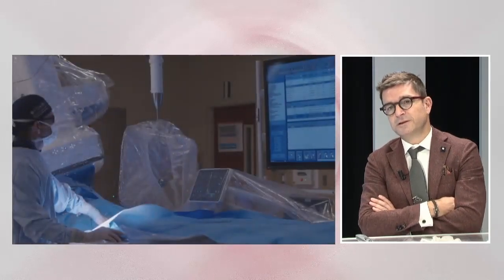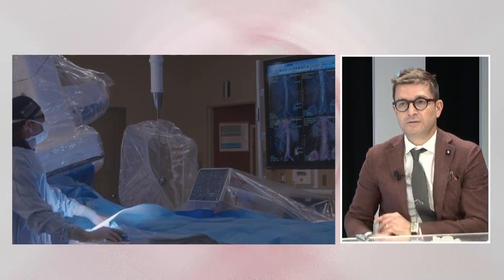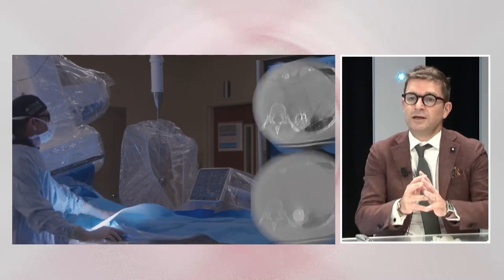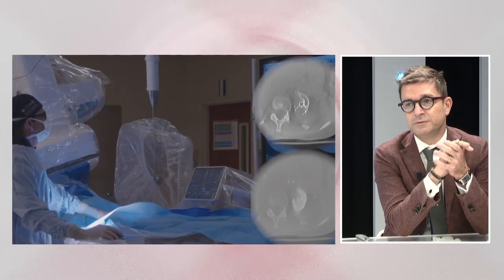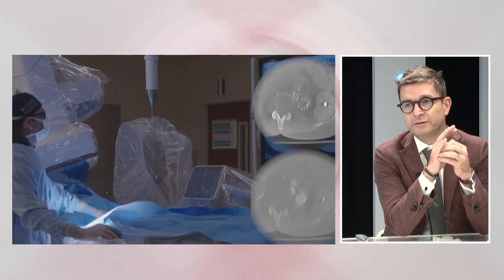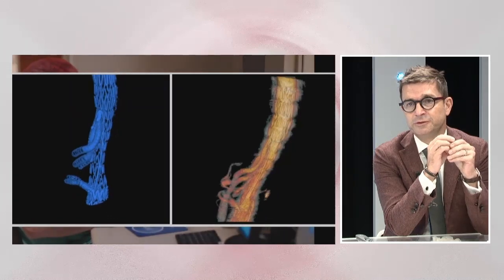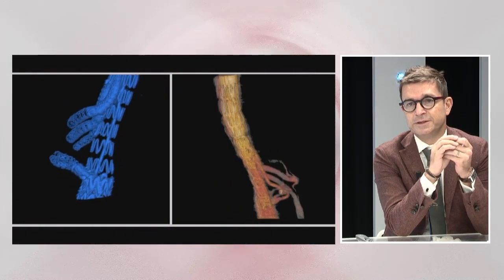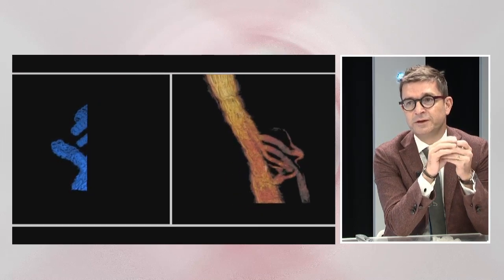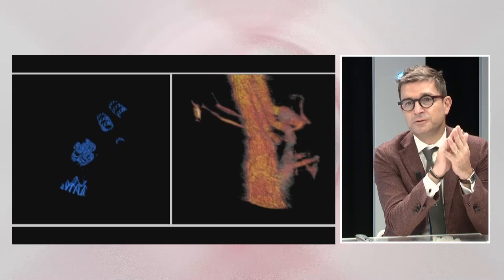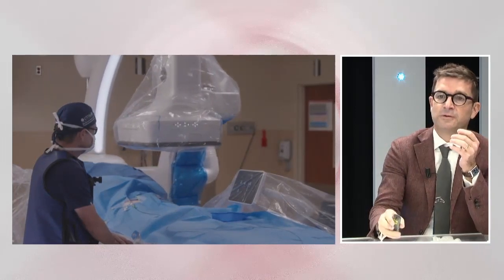That's Mark Farber with me looking at the angiogram — I did balloon this primarily because it's inside the Dacron graft. We're setting up the cone beam CT — and again this is real-time speed, unedited. We create the high-definition mask and then the second acquisition with contrast, which creates a rotational DSA. The injection protocol is a 5-second injection with a 2-second delay, at 15mL per second diluted to 50%, which is about 35mL of contrast.